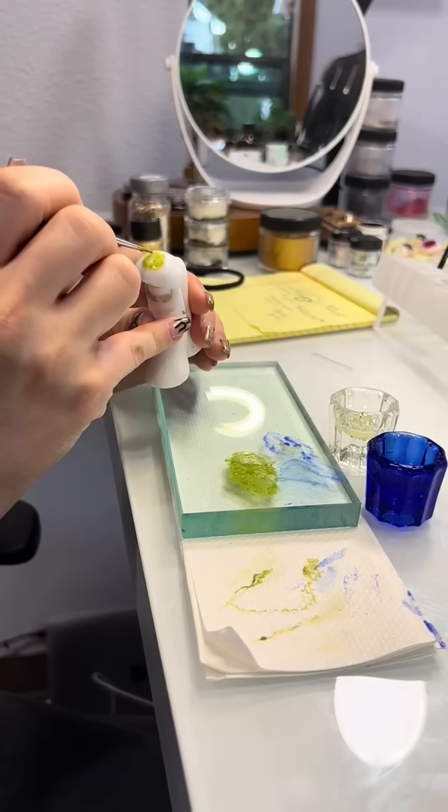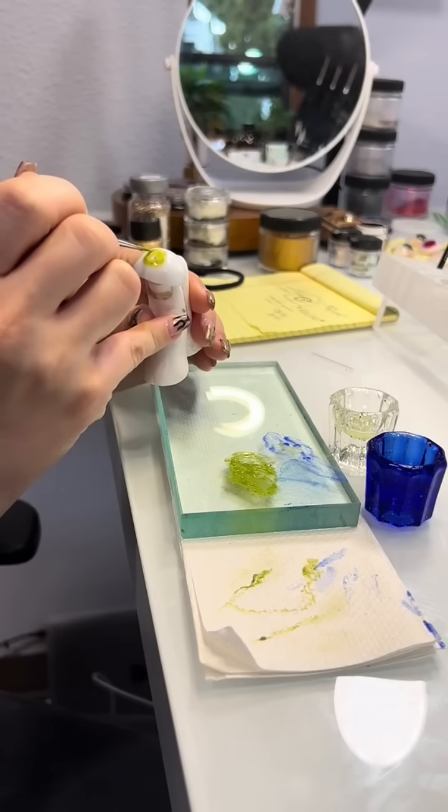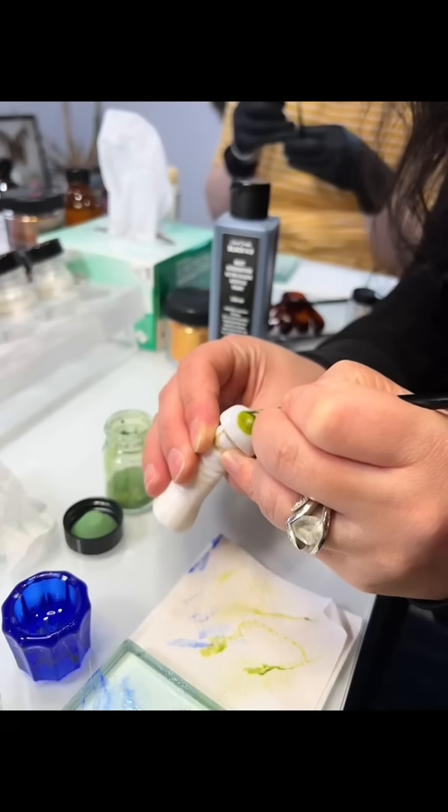Now I did do most of the work here, but I couldn't get the iris to look super circular, so I did have to hand off the eye to Christina for her to ensure that it looked like a circle, because again, as much as I wanted to paint this whole thing by myself, I did want to wear it and have it look decent, so I had her help me along the way.